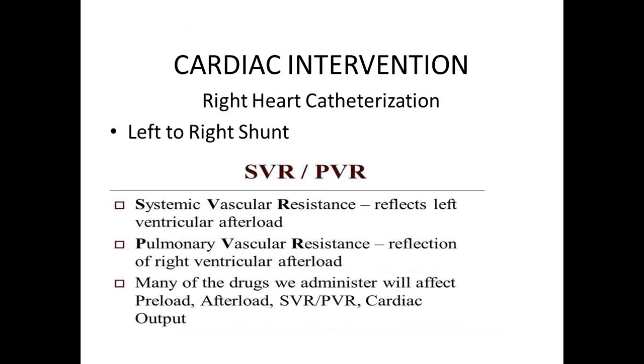Sometimes you don't go through all of these measurements. If, say for instance, the patient has COPD, chronic obstructive pulmonary disease, and they have elevated pulmonary pressures, you don't have to do your oxygen step up and things like that. If you're not sure of the etiology of the elevated pulmonary pressures, then you have to go through everything, all the steps.